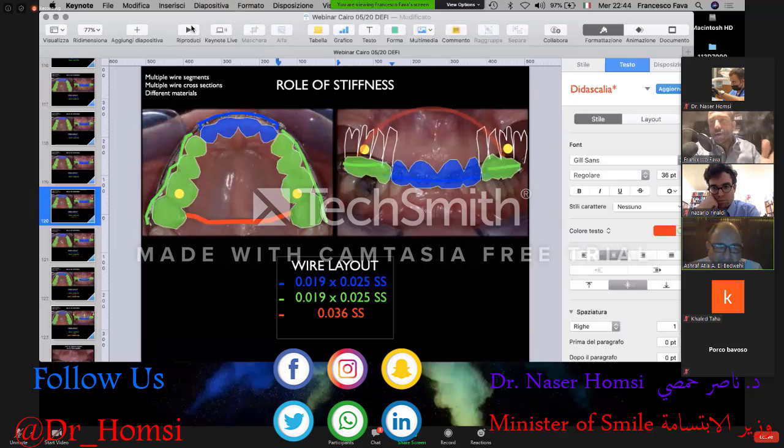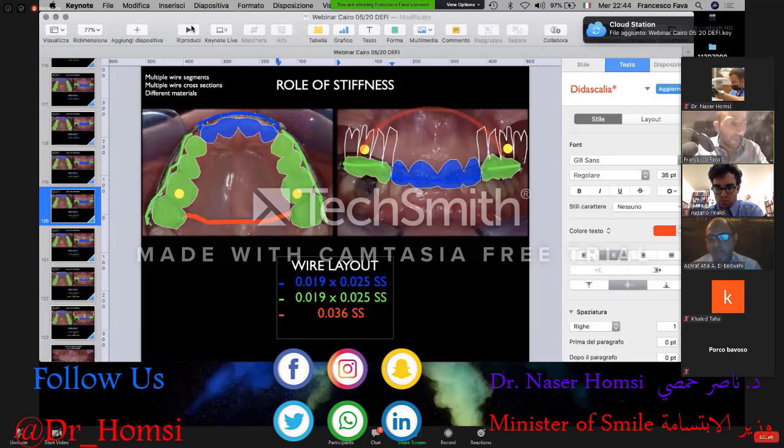Or we can choose TMA, which is much more elastic and it's very useful to move the teeth. So the guideline is when we want to create anchorage, we need the stiffness, so stainless steel is the best material. If we want to do some movements, today we have just talked about the passive use of the transpalatal arch and bars. The best option is stainless steel because it's much more stiff.